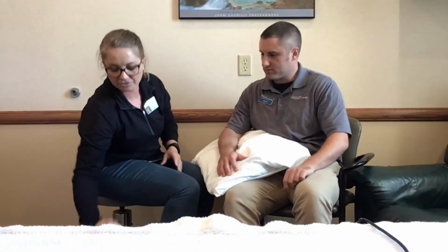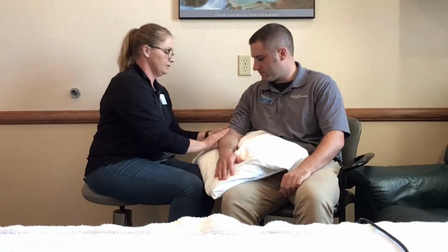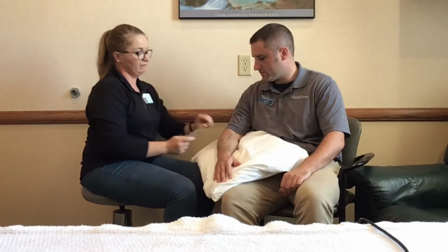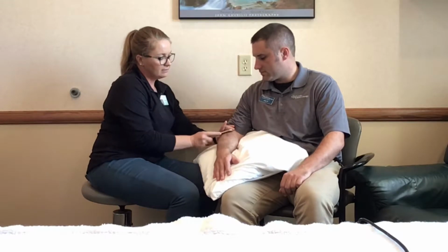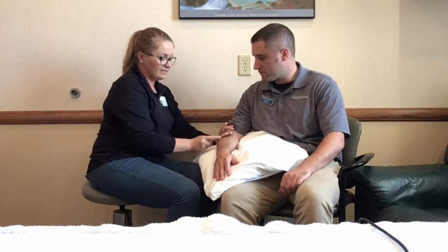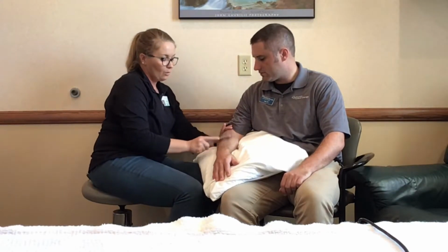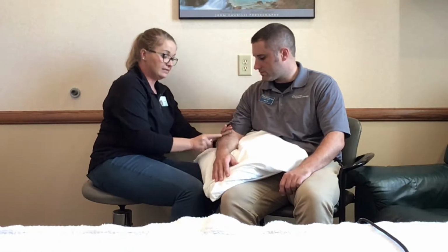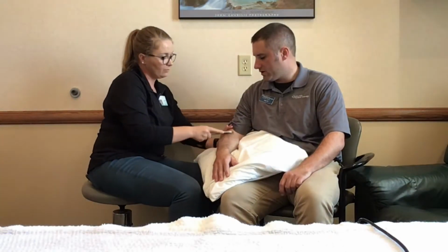So let's say Josh has tennis elbow, okay? We just put a little lotion on the area so I don't rub it raw and to make sure the tool glides easily. A lot of times I'm just coming in like this, and it's kind of neat, honestly, if there are some trigger points or tight muscles, I can feel grittiness through the tool itself, and I can feel that go away. So I usually work that area until I get it nice and smooth, or if it turns bright red on me, I quit. Gotcha. Because I don't want to bruise the patient.